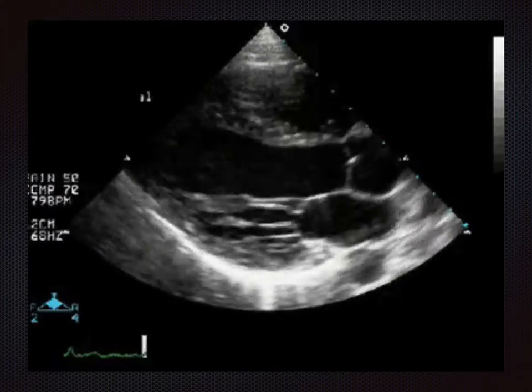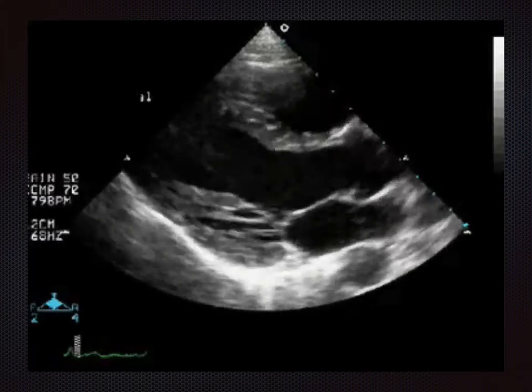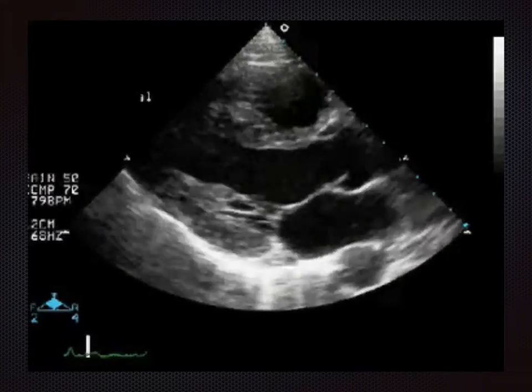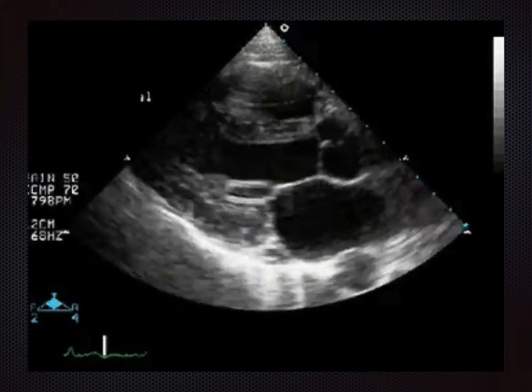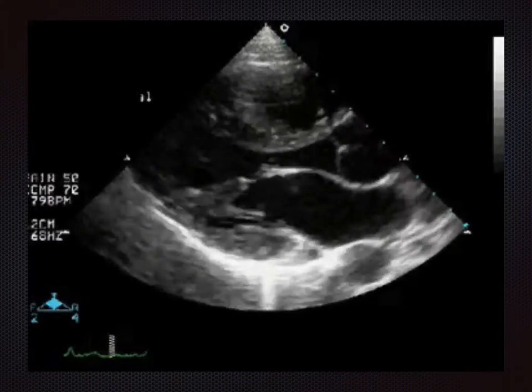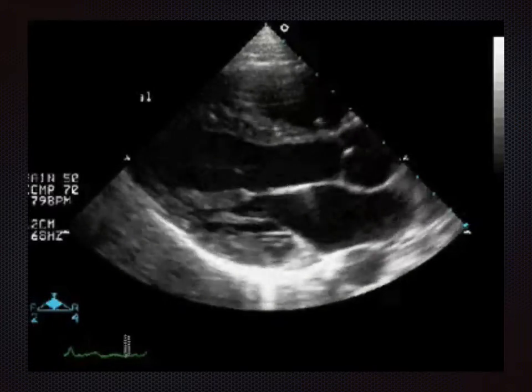Now the left ventricle has fibres that run in different directions embedded in it, and some of them cause thickening, some of them cause radial contraction. So as you can see, the internal width of the chamber is reduced by about a third during systole, and that's easy to see on this view. And often you can do measurements of these things, but really just by looking for the thickening of the left ventricular wall area of interest you're looking at.